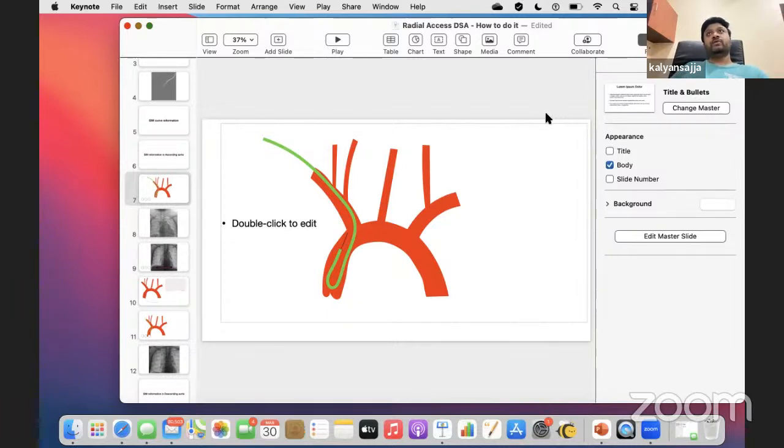In our experience, I think we have done more interventions this month than diagnostics. And in most of our cases, we used a 7 French Fubuki, and it just tracked up very beautifully. The 6 French Fubuki has some problems. The 8 French, the 088 inner diameter Fubuki, has some problems, but the 7 French is really good.